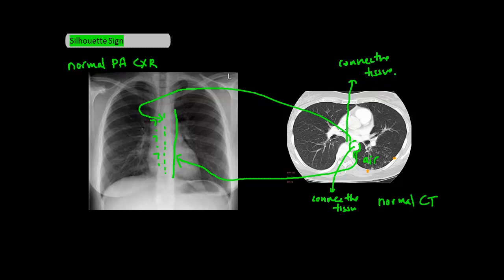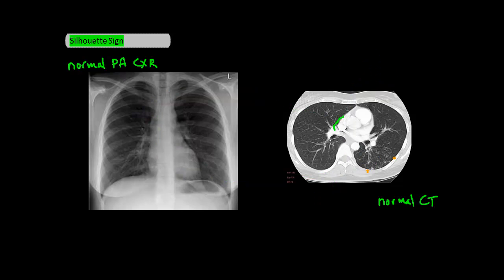Now let's take a look at the left and right heart borders, which are here on the CT. The heart is basically the density of connective tissue, and because of the left and right heart border touching the air found in the lung, we can see nice sharp borders on the frontal chest X-ray.